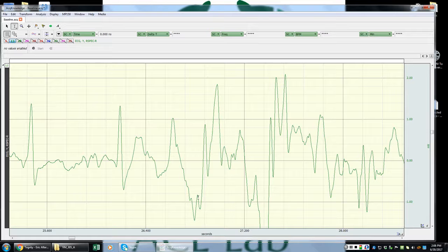This one, about the same. This one might also be a little bit too broad and wide, but maybe this one right here fits the bill a little bit. And then maybe this one right here, or one of these three.